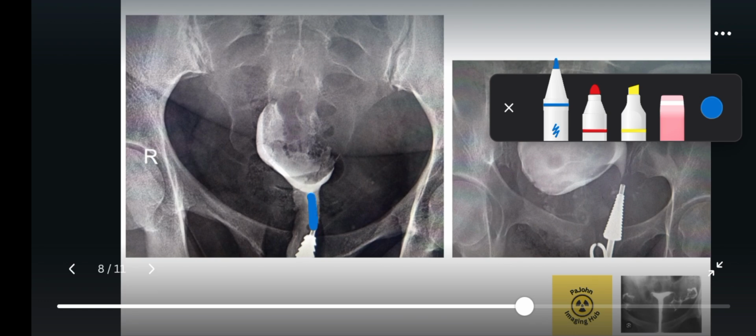Then we'll see this case here. This is the cervix. Now this is the inside of the womb. Now we see this structure here, a tumor or fibroid inside the womb. Now we could not make out any tube from this womb. We didn't see any tube. So it's a case of fibroid and the tubes are closed.